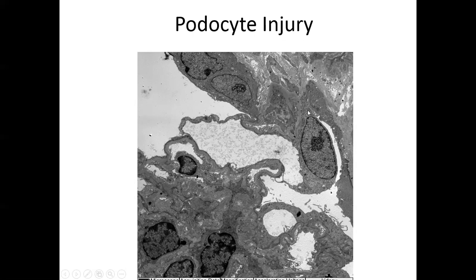And we even have connection between this podocyte and Bowman's capsule. So there is some discussion about whether or not these podocytes can be part of the parietal epithelium, whether they can interact with the parietal epithelium, whether they can transition from visceral epithelium to parietal epithelium. Obviously, lots of research needs to be done, but I think it's a pretty picture.